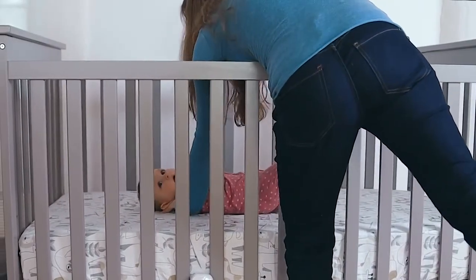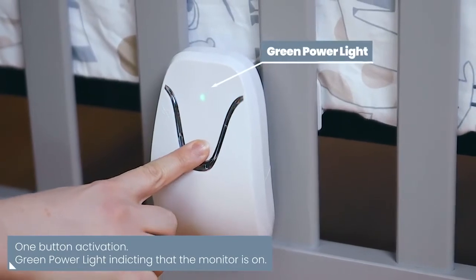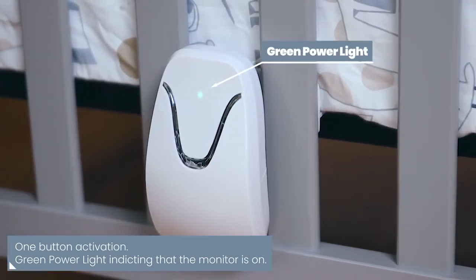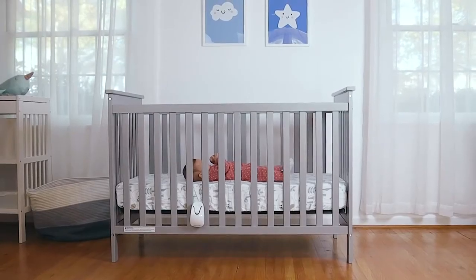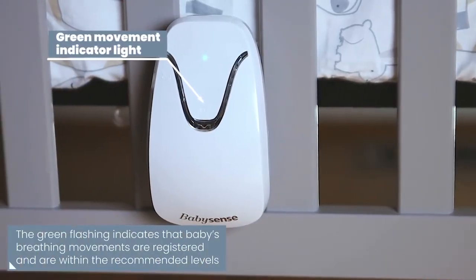Your baby won't even know the monitor is there. Easily activate the monitor by pressing the power button. The green power light indicates that the monitor is turned on, and the green flashing light indicates that your baby's breathing movements are registered and are within the recommended levels.